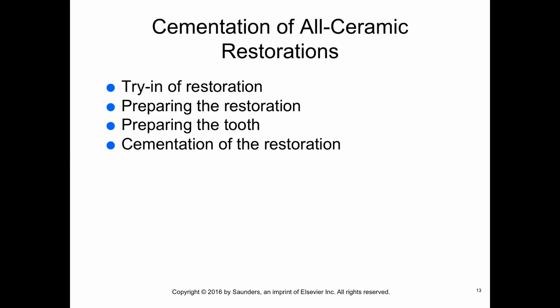You can take a microbrush and wipe away that excess cement. And then depending on how that cement cures, you can use a light cure or self-cure. You just have to make sure you get that excess cement off.